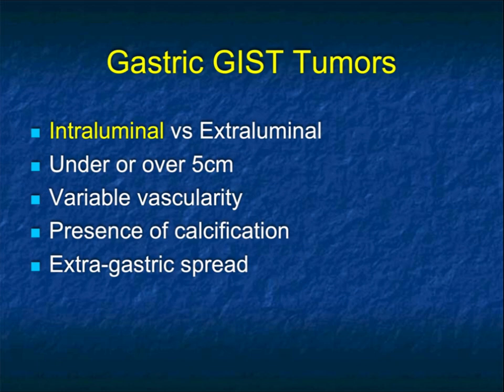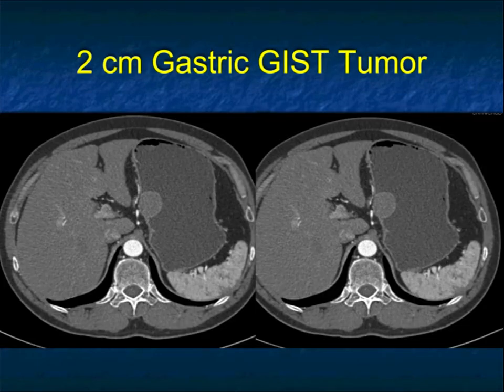When looking at GIST tumors on CT, I evaluate: intraluminal versus extraluminal location (intraluminal is less common); whether they're over or under 5 cm (aggressiveness is defined by this); vascularity (smaller tumors are more vascular); calcification (rare but does occur); and extra-gastric spread (also rare but does occur).